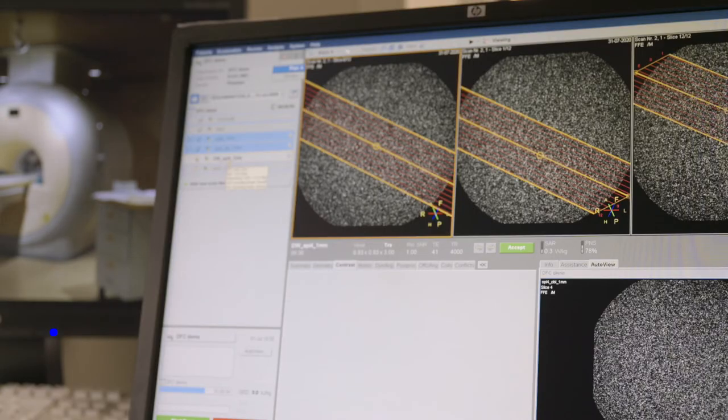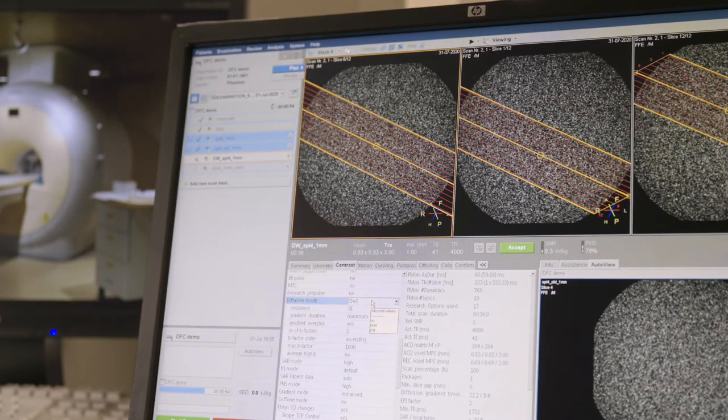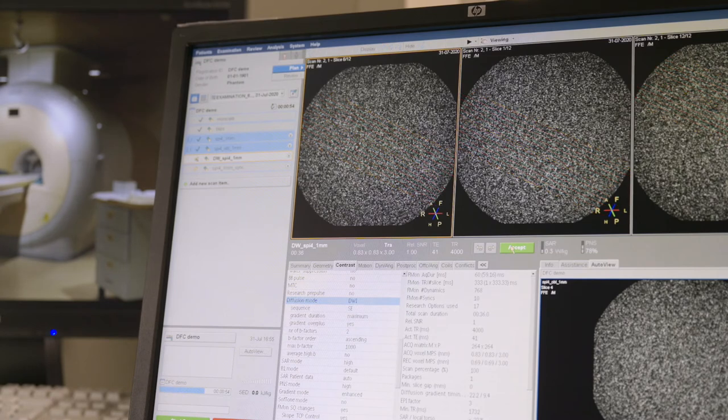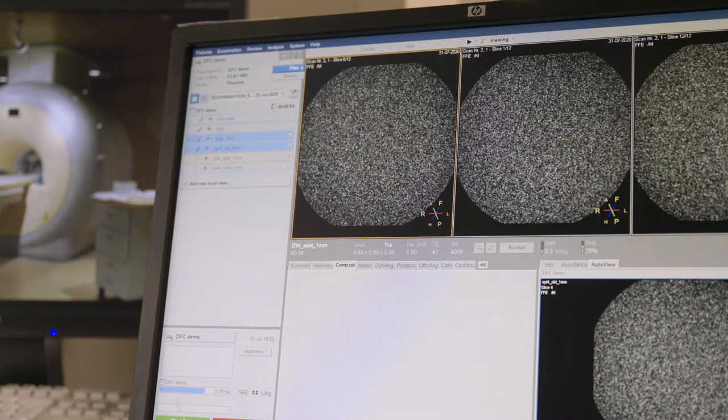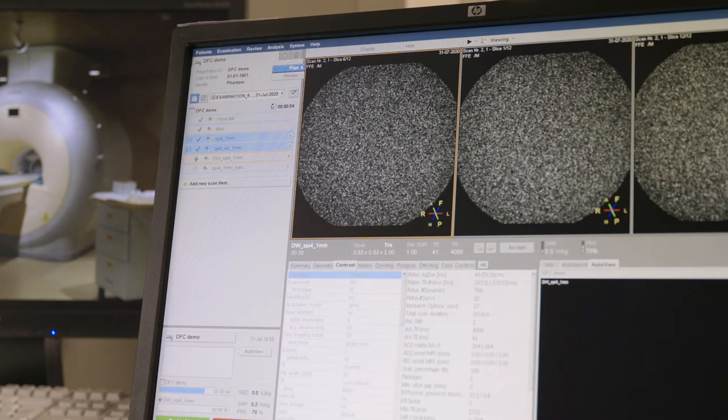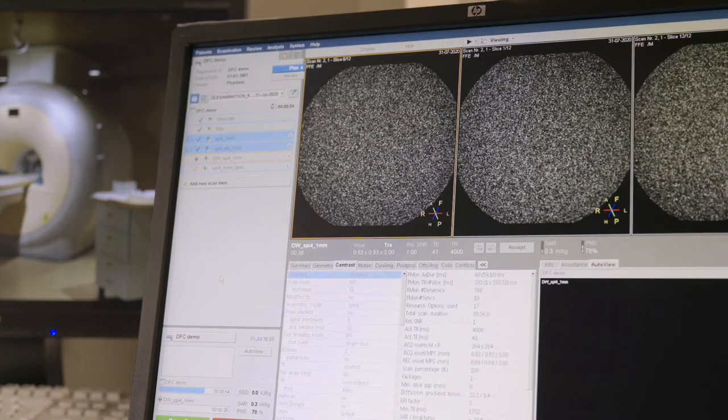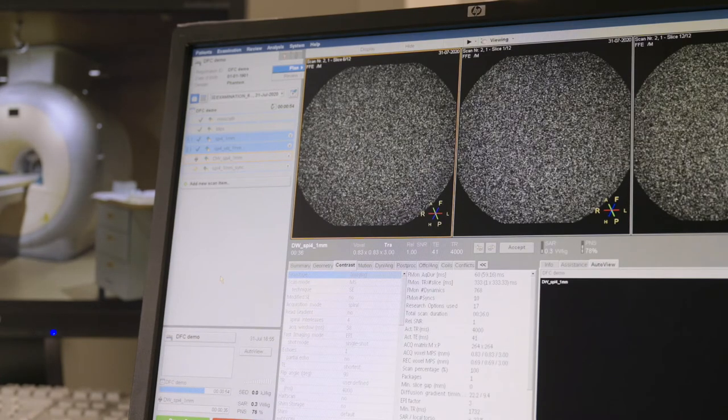Now, let's return to scanning and add a diffusion preparation to our spiral sequence. Spiral diffusion imaging is particularly interesting since diffusion applications are very often limited by low SNR and low spatial resolution. By choosing a spiral readout instead of EPI, we can shorten the echo time and thereby significantly increase image signal.